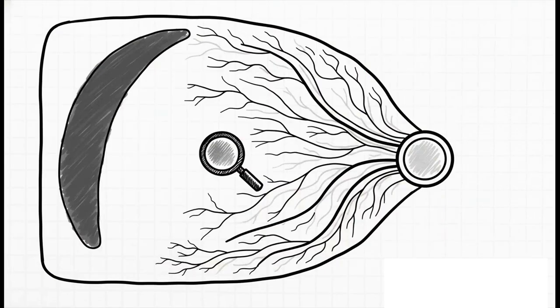For example, take a look at an arcuate scotoma. This isn't just some random blob of vision loss. No, it follows the precise, elegant arc of the nerve fibers as they sweep across the retina. It's like seeing a shadow that perfectly outlines a hidden structure. This specific shape is a classic telltale signature of damage from glaucoma.